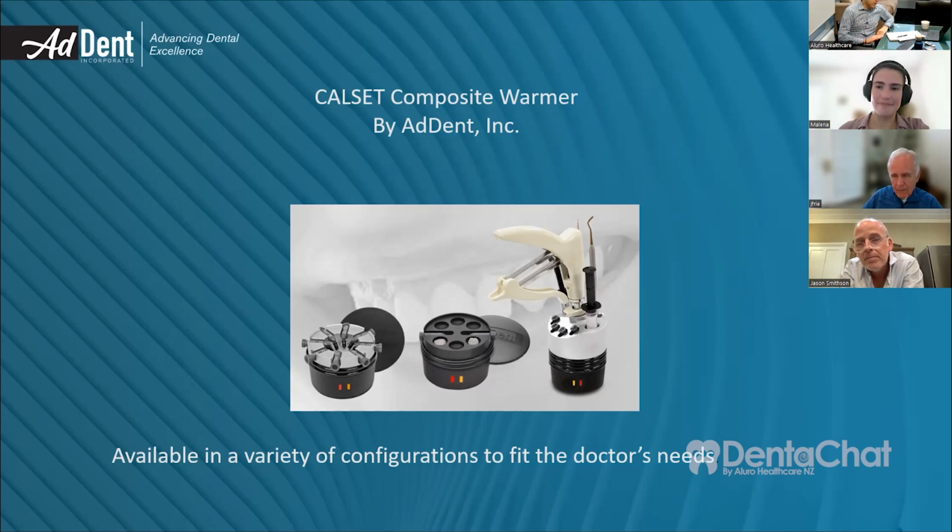My question was, you've been using it for 10 years. What do you use it for the most? I know it's a composite heater, but is it every single composite? Have you found new ways to use it, like the veneer cement Josh was talking about? Some dentists buy it thinking they're going to turn a packable composite into a flowable, and obviously that doesn't happen, and then they just use it on and off. My understanding is that you should be using it for everything.